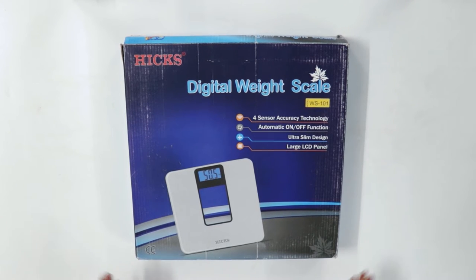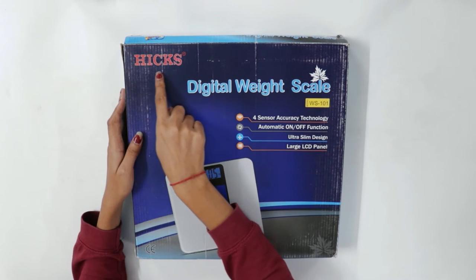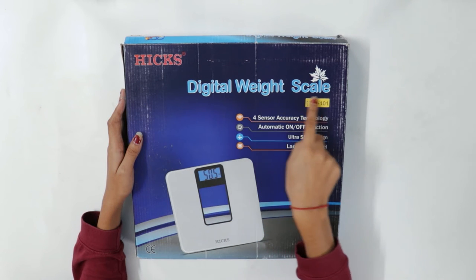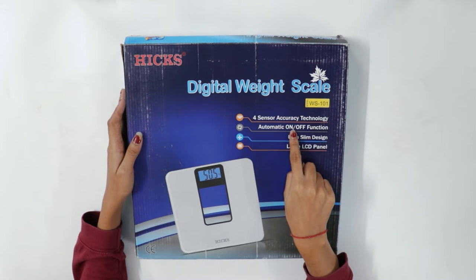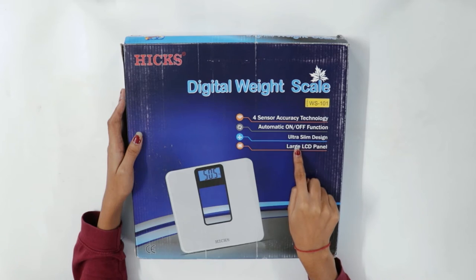Hello everyone, today we are going to unbox the Hicks weight machine. At the top left, the brand name is shown, and below it the name of the product is mentioned. It has four sensor accuracy technology, automatic off function, ultra slim design, and a large LED panel.